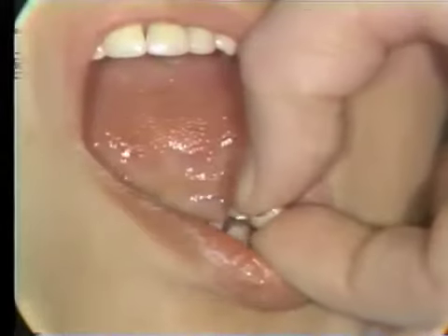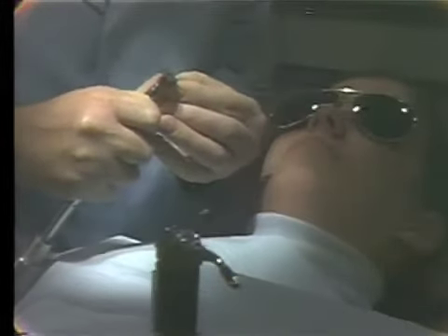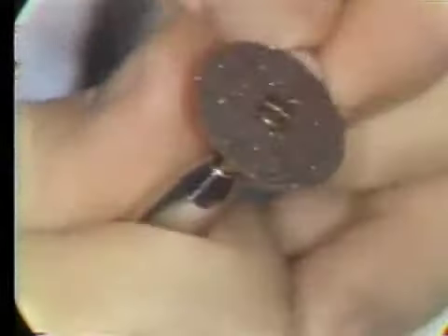We will take this crown now and start working down the porcelain. Improving the contour of that restoration. Can you throw a little air on there, please?